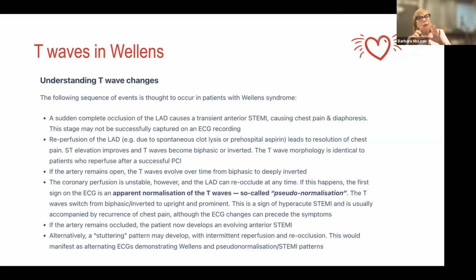When we look at an EKG and we say, this EKG is not normal, but I'm not really clear why it's not normal, but my troponin is elevated. My patient has kind of a poor historic presentation, but he has an acute rise in his troponin and he has an EKG that doesn't look normal. I want to make sure that I identify that cardiology needs to be called.